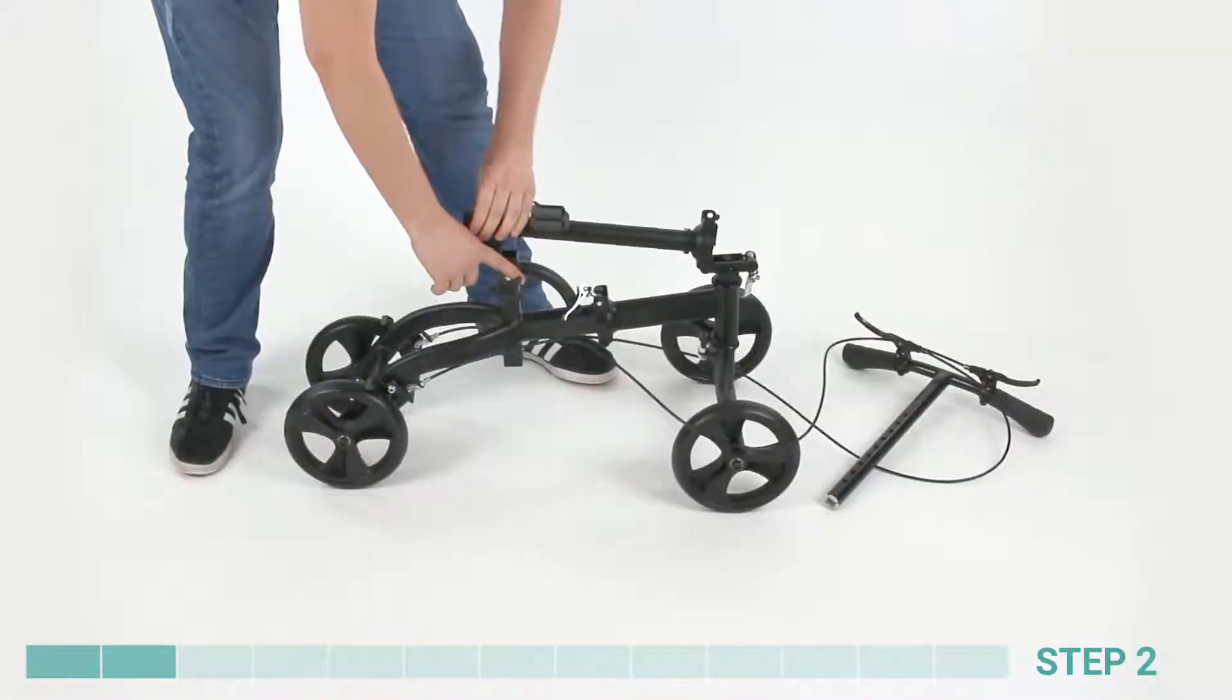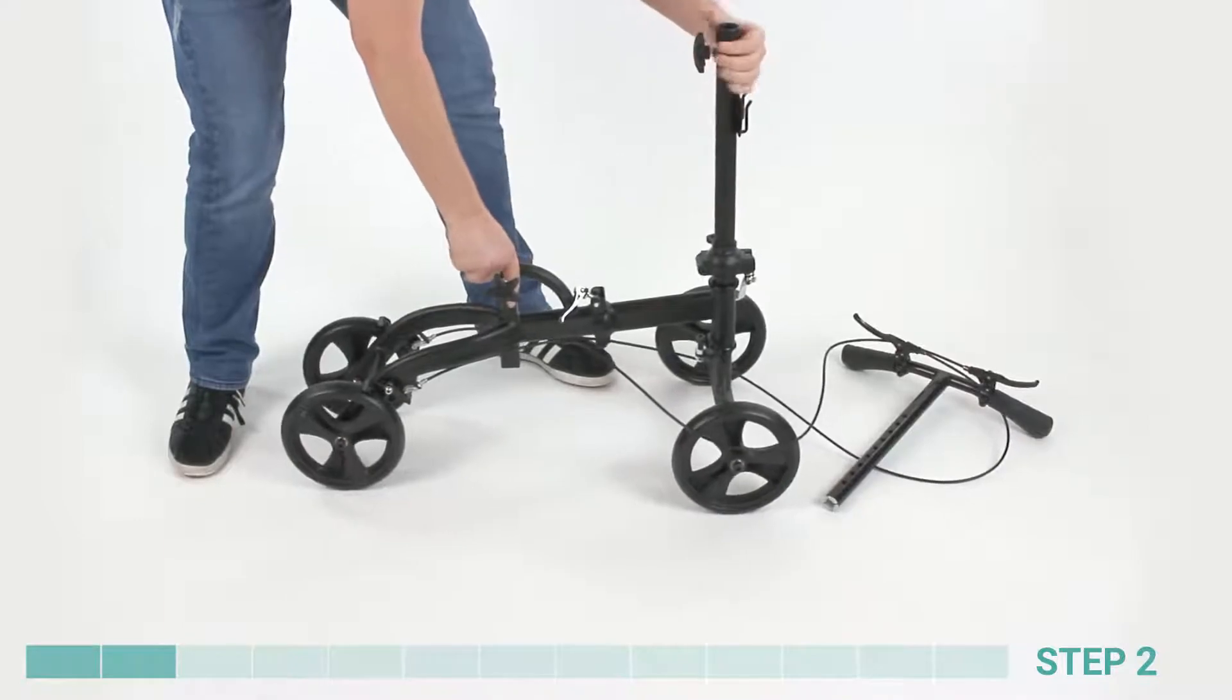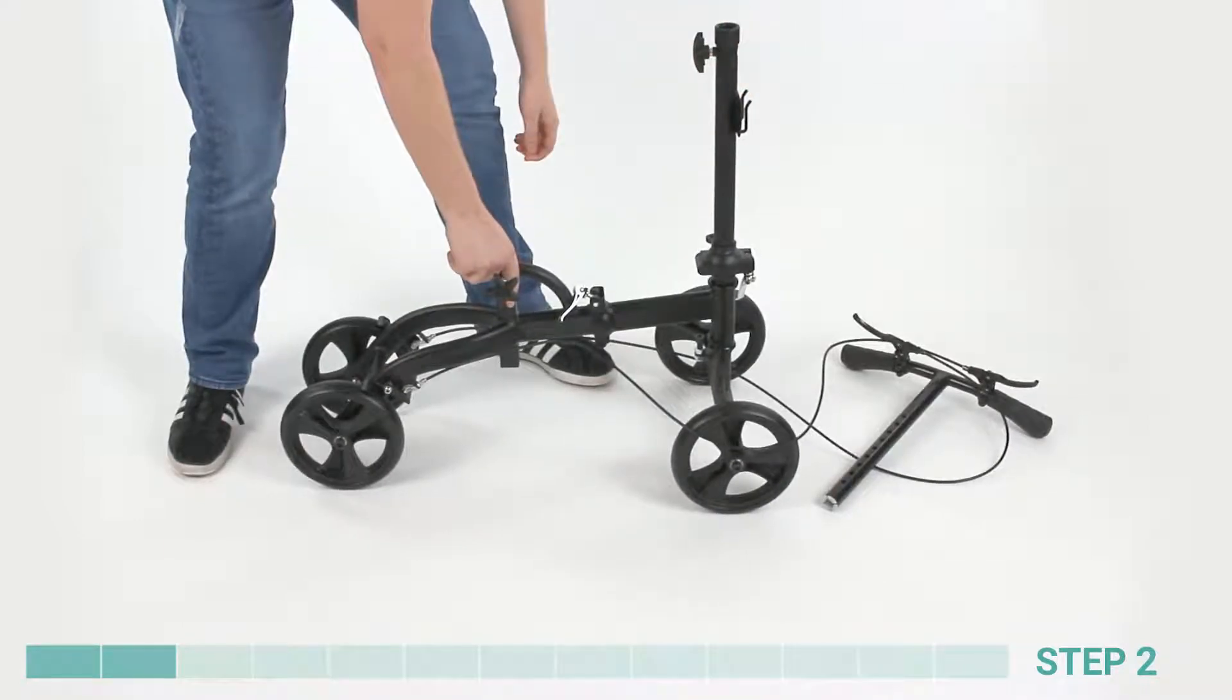Step 2. Lift the steering column up until it locks into the folding joint over the front axle.